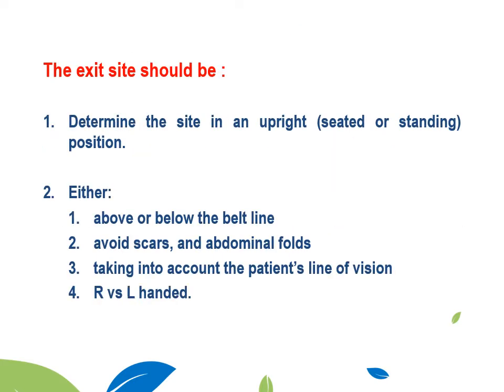And as we agreed, the exit site is very important to determine its direction and its position. Whenever you mark it on the patient, it should be marked while the patient is in an upright position, meaning he should be seated or standing. Never do it while the patient is lying flat, because whenever the patient comes straight during a later dialysis session, by gravity, the abdominal wall would move with the catheter and it will change position, so that it will have some kinks that will change all the inflow and outflow procedure. So always do it while the patient is in an upright position.